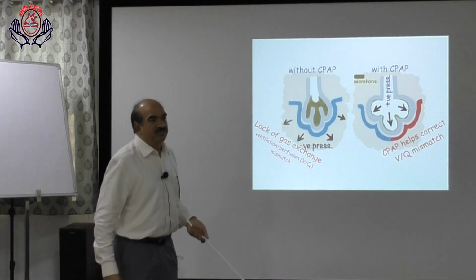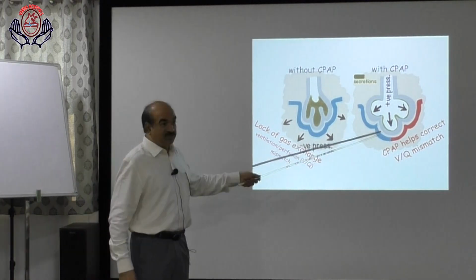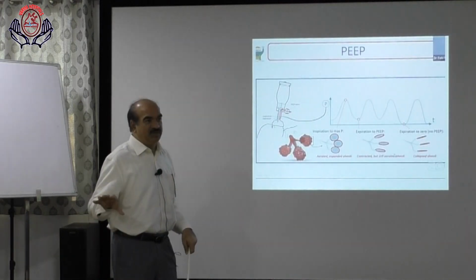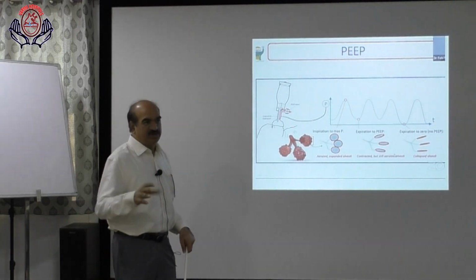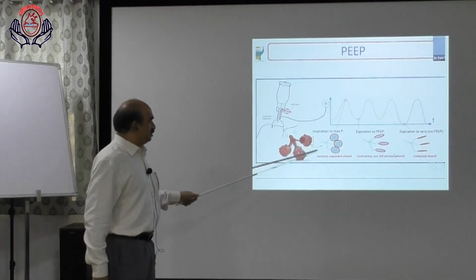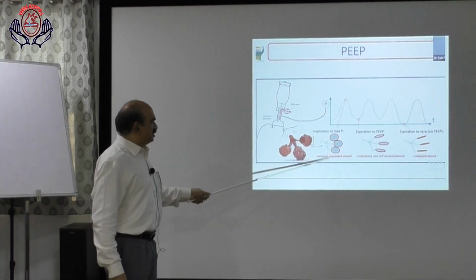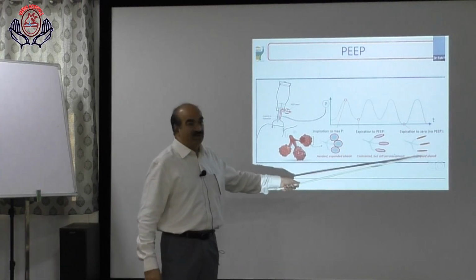Control modes. In control modes, routinely we use volume control mode. But if there is severe ARDS with significant alveolar damage, we have to go for pressure control mode. If there is severe, predominant alveolar damage, we should look for pressure control or pressure support mode. In ARDS there are various zones: in some zones alveoli are normal, in some zones they are diseased. With CPAP, there will be expansion of alveoli; some are contracted but still well aerated, and some alveoli are collapsed.